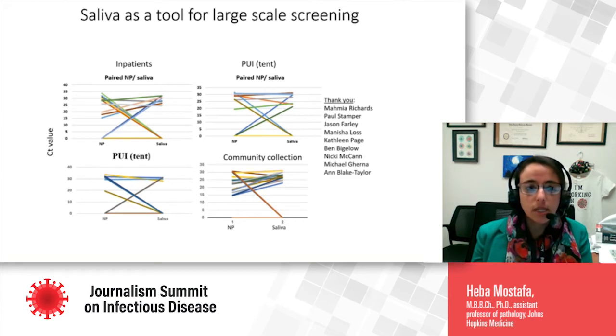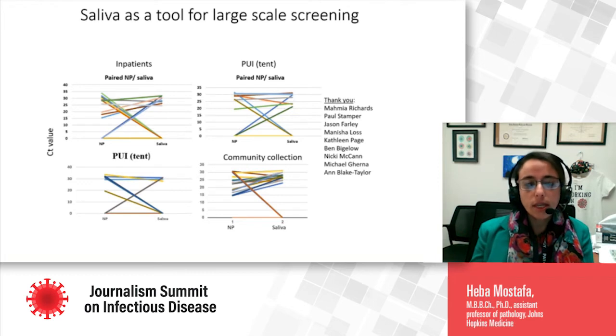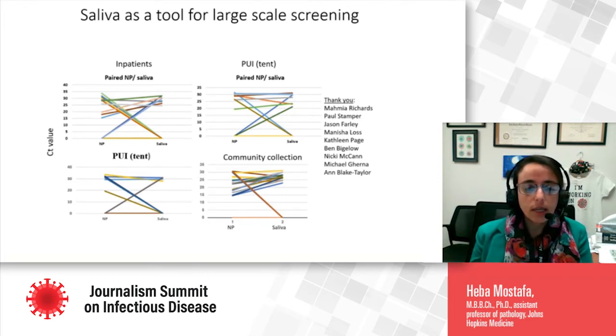As you can see in these graphs here, those represent 4 different experiments we did in the lab. We never reached that percent agreement, and the sensitivity in relation to the nasopharyngeal swab was always around 80%. Now the situation has changed, and we can now validate this specimen source as a matrix, and we are able to offer this right now for testing.